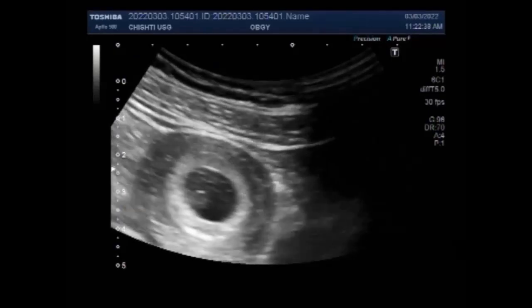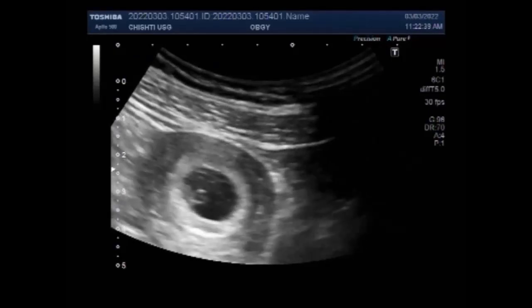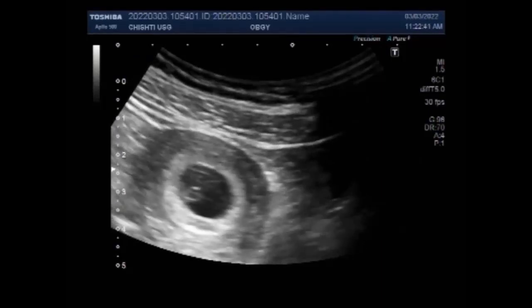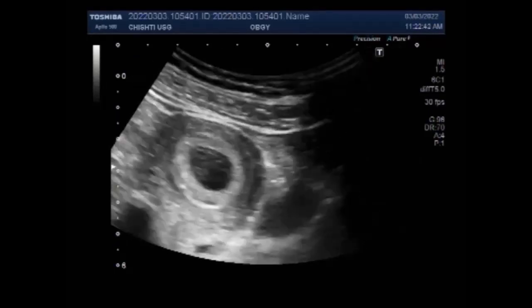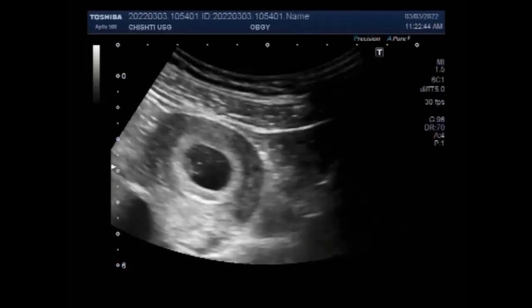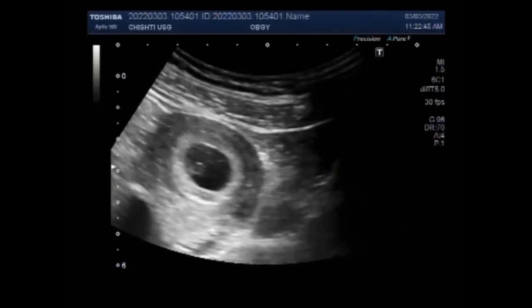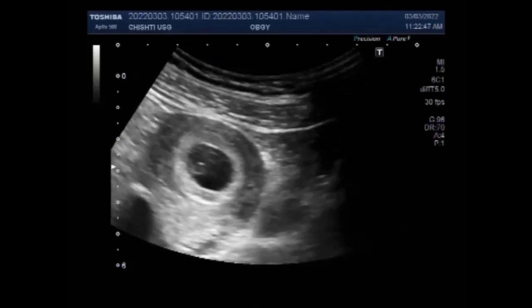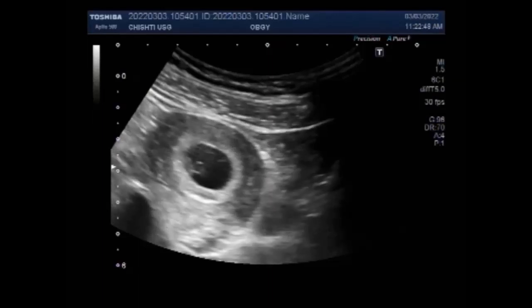So, most ovarian cysts do not cause infertility. As you can see in this case, the ovarian cyst is seen along with the pregnancy.